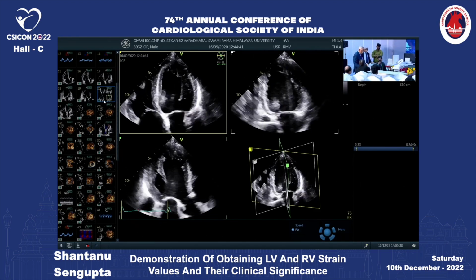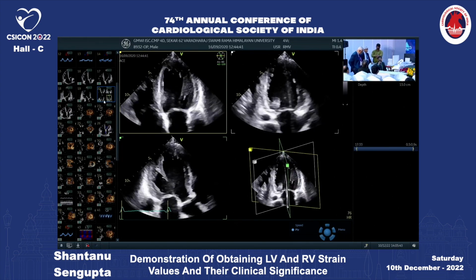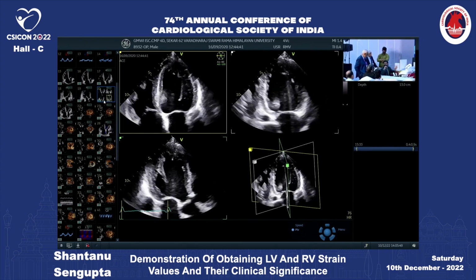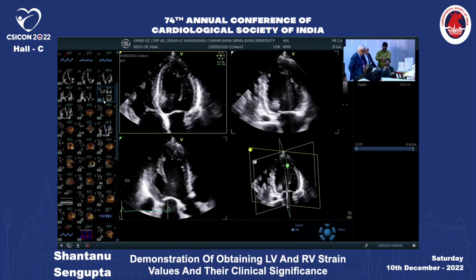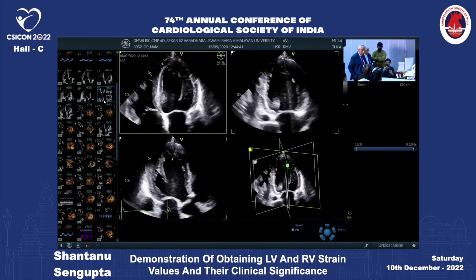So let's see. My report goes like, so let's say he's a hypertensive guy. I will say hypertensive heart disease, concentric LVH, LV ejection fraction of 60%, type 2 diastolic dysfunction, E by E prime of 11, GLS of minus 12.1, no MR, whatever it is. So you are identifying subclinical LV dysfunction. It is a marker of early HFpEF.